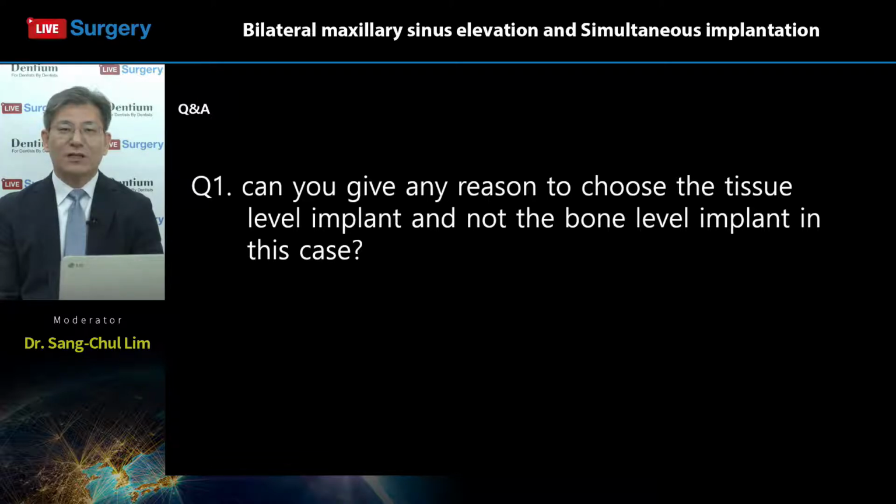What is the big difference actually? The connection. Connection is an important factor, especially in load bearing areas like the posterior mandible and posterior maxilla, numbers 26, 25. Internal connection is a unique connection system, the ordinary system of bone level implants available in our market and practice today. With a wide diameter, internal connection doesn't matter, no problem, right? However, with narrow diameter it is a totally different story, like a 3.0, 3.5 diameter internal connection. What do you think about it?